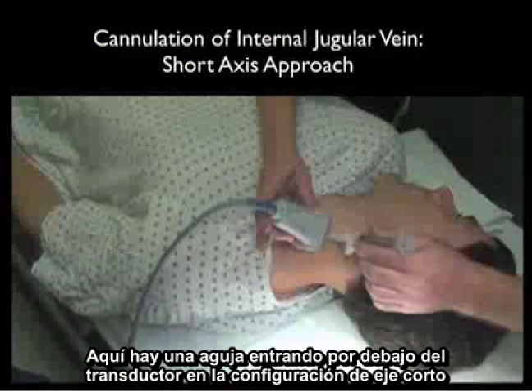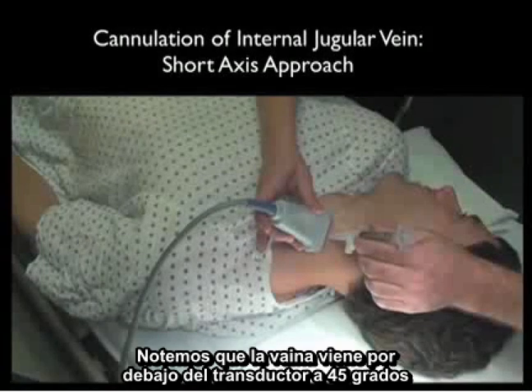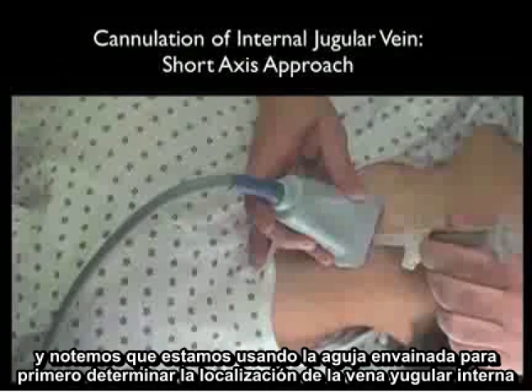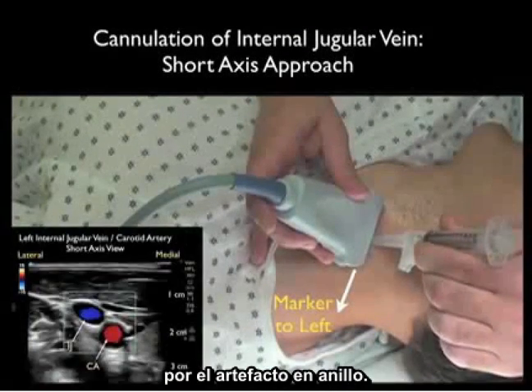Here's the needle coming in underneath the probe in a short axis configuration. Notice that the sheath needle is coming in at a 45 degree angle, and we're using it to first determine the location of the internal jugular vein by the ring-down artifact.